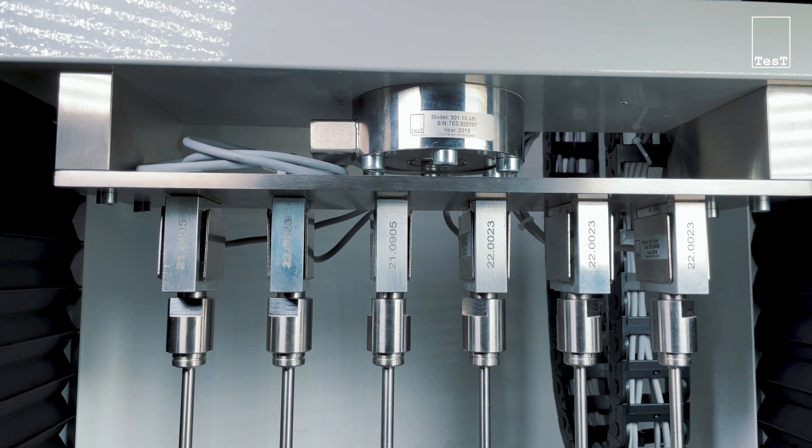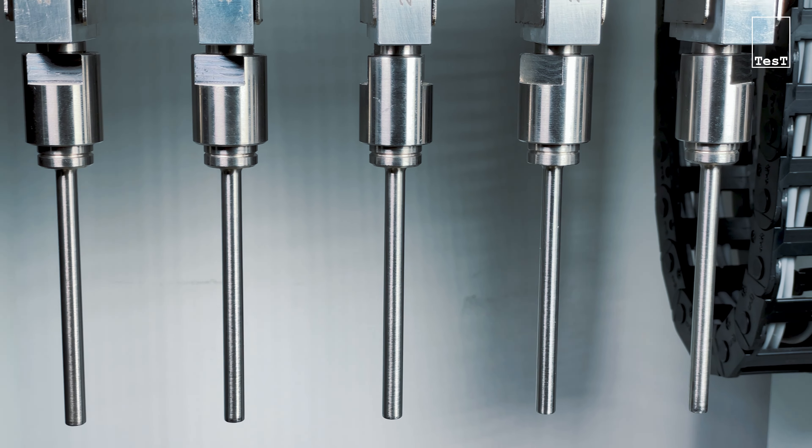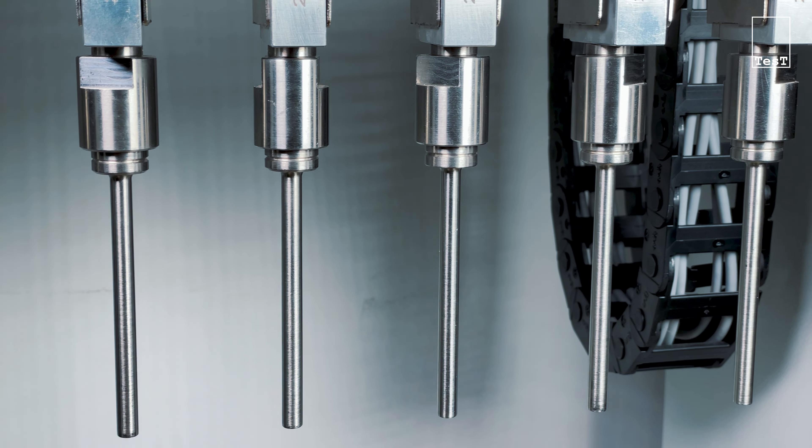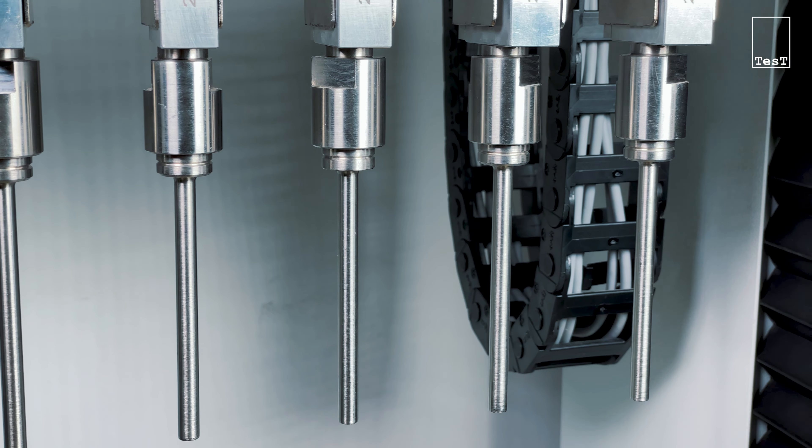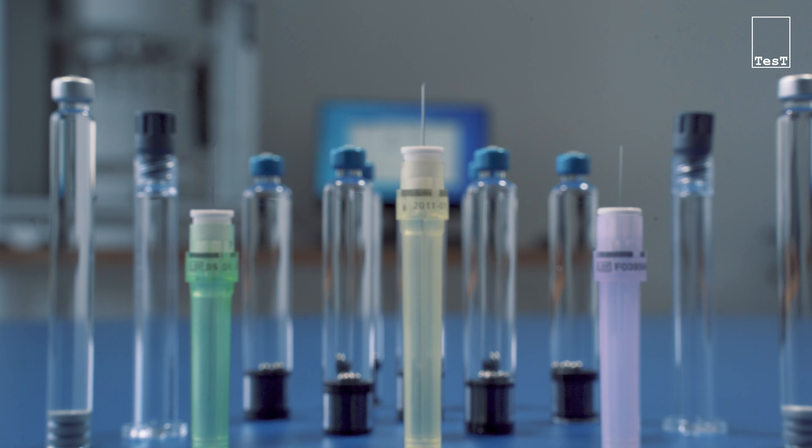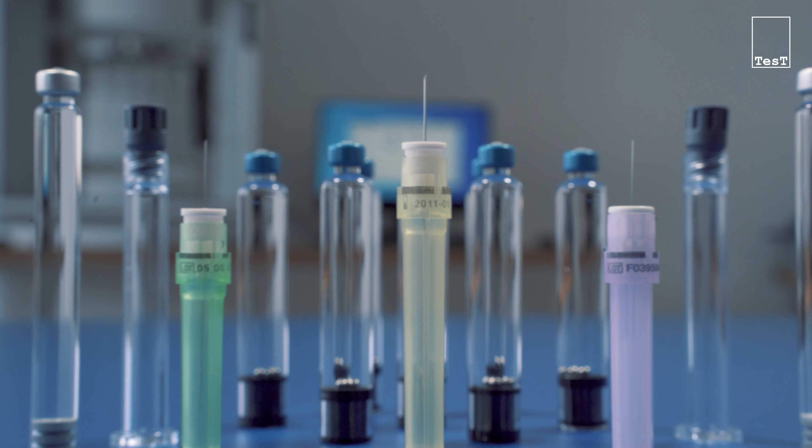Besides cartridges and syringes, TEST also manufactures testing machines for various other pharmaceutical packaging.